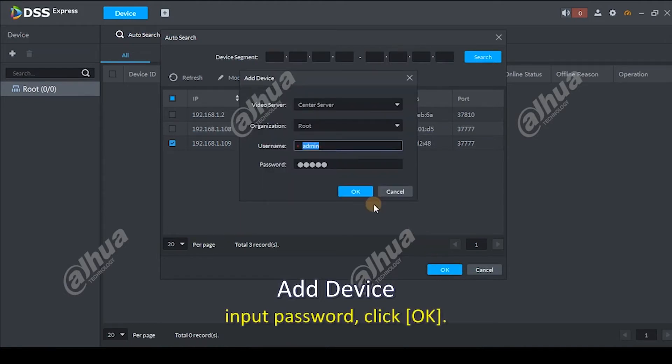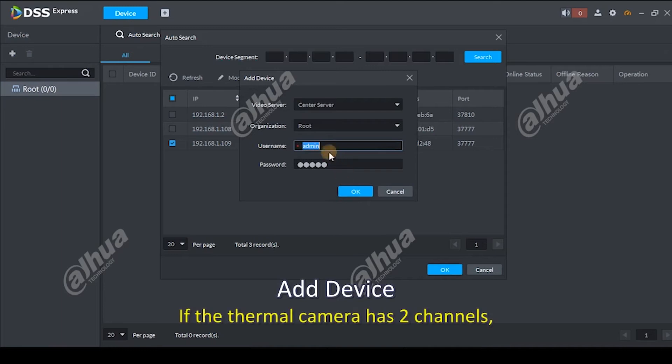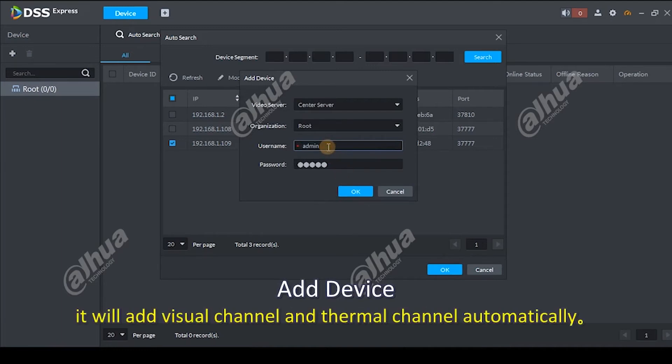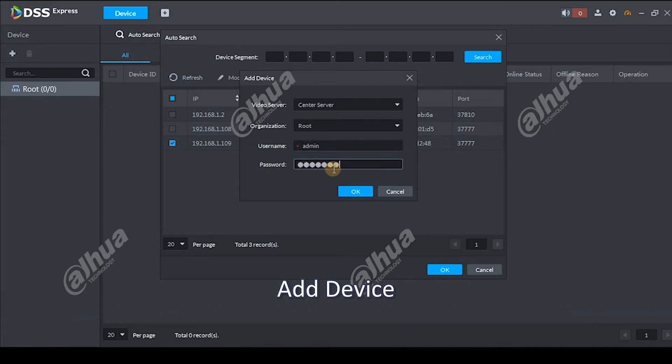Input password, click OK. If the thermal camera has two channels, it will add visual channel and thermal channel automatically.